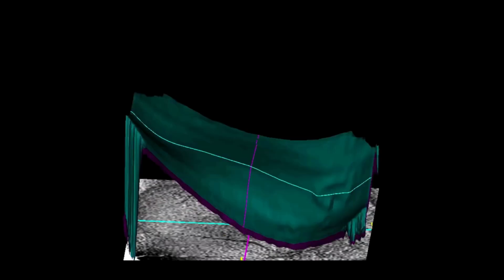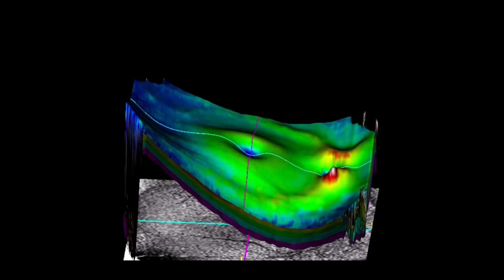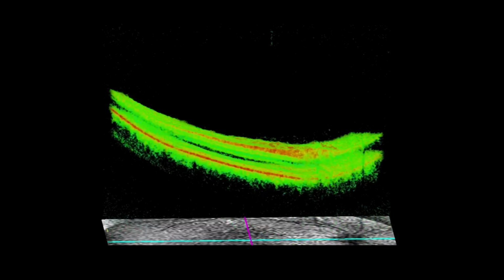Obtaining both volumetric OCT and topographical map, software can render a 3D cube of the macula, which can be segmented into different planes, along with horizontal or vertical, to study retinal layers in depth, along with 3D rendering of the vitreous, which is very helpful to see the vitreomacular tractions when planning to do pars plana vitrectomy.